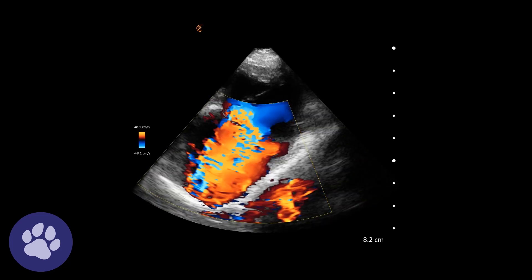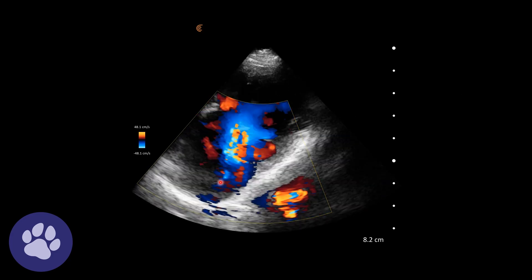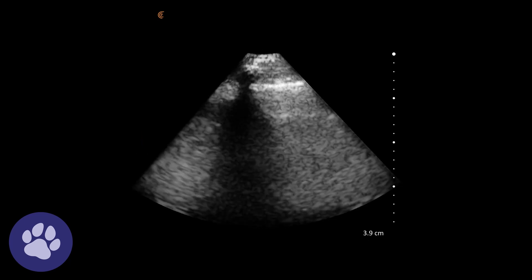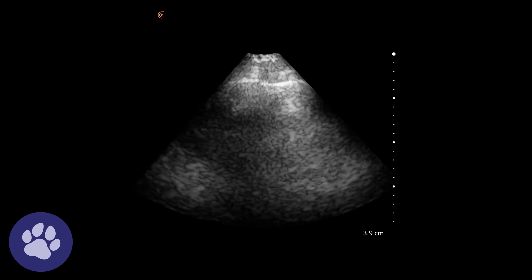Adding a bit of colour flow mapping on, we can see the regurgitation in the left atrium. Assessing the lung fields, there is an occasional B-line, but not enough to suggest that the lungs are wet.